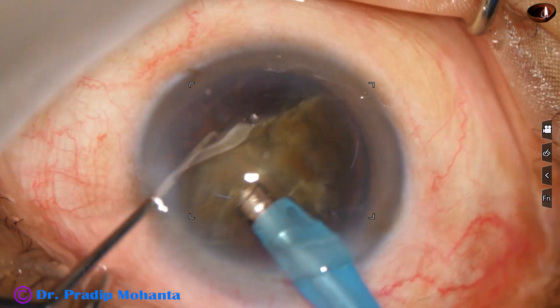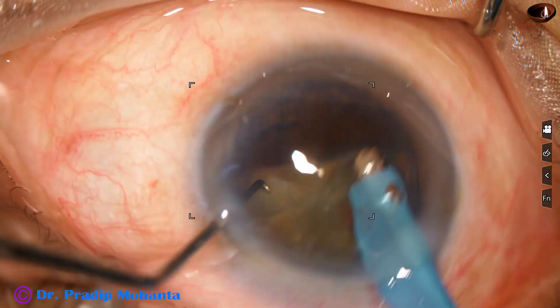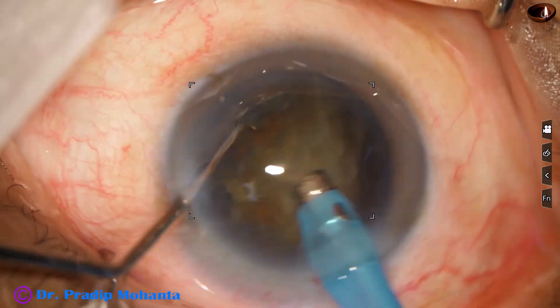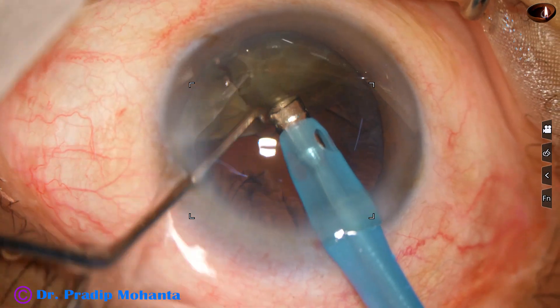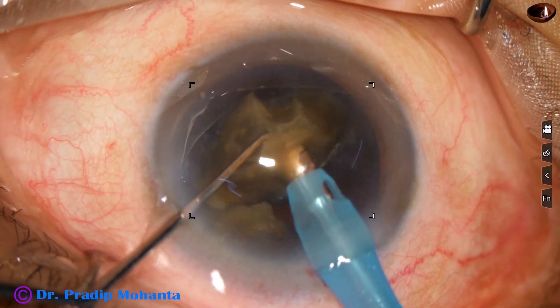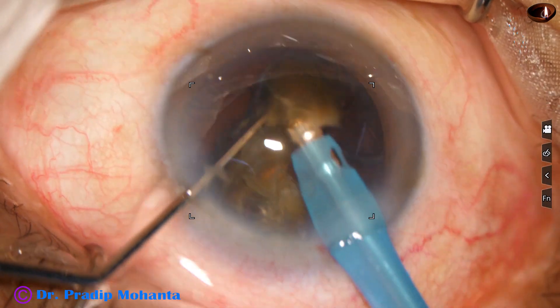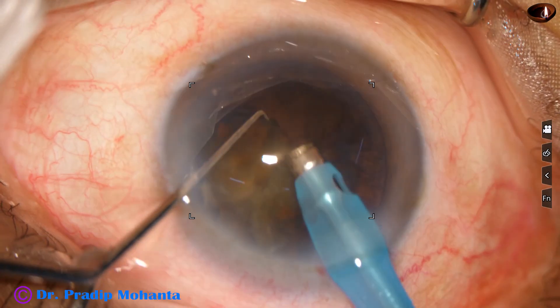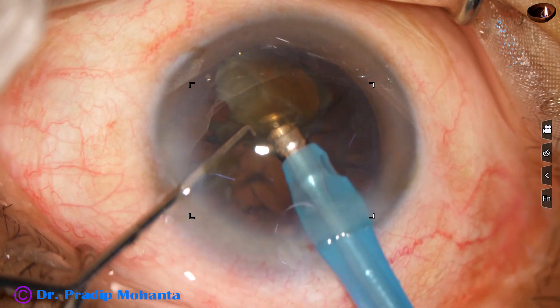And now the other heminucleus — the two pieces are still not free in this case; they are joined to each other near the center. We can just tilt it. Now it is free. As a little energy is applied to the band joining the two pieces, they become free. Then each nuclear piece is worked on with ultrasonic energy and they are eaten up.